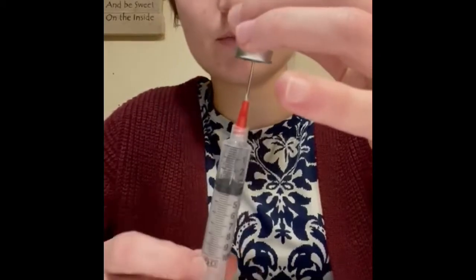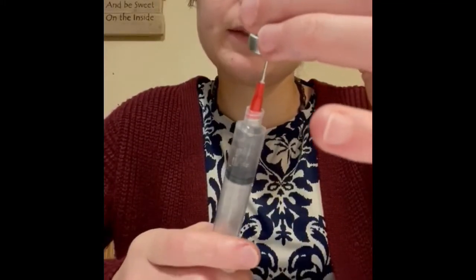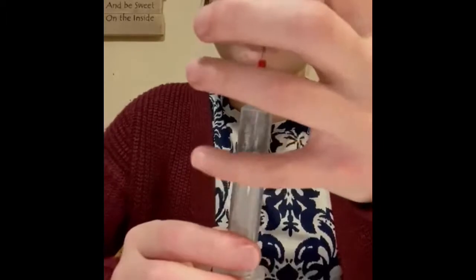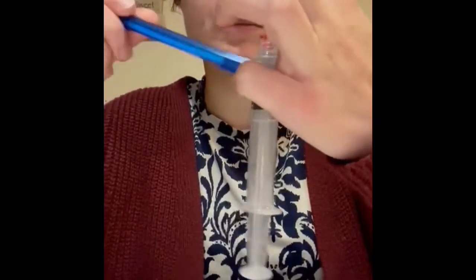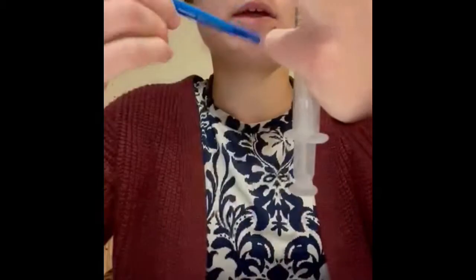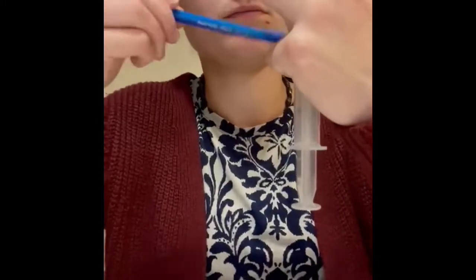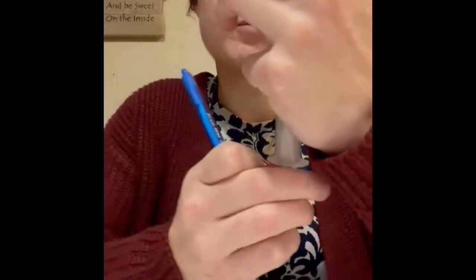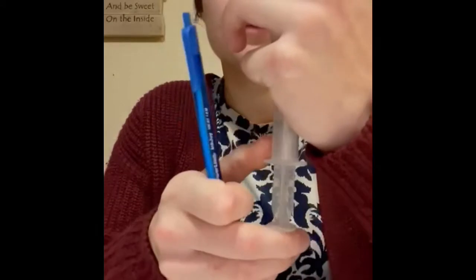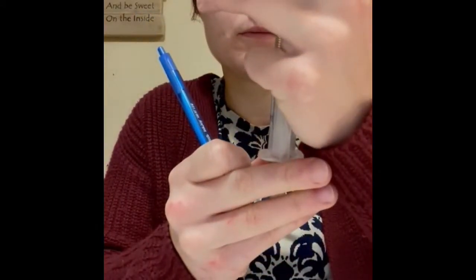So I see no more bubbles. Make sure it's at 4. And then there's a little bubble at the top. So I'm just going to get that out. Draw back a touch. 4 again.